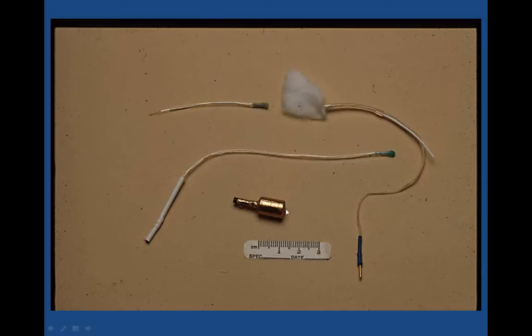And then, of course, this is a very popular electrode. I would say a lot of clinicians who are doing electrocochleography today in their clinics are using this electrode and using the ear canal recording approach. We abandoned that several years ago simply because it's not nearly as sensitive and stable as the recordings we get from the tympanic membrane. Nonetheless, if you cut this down a little bit and get it real close to the eardrum, you might get responses that are similar, but in our experience it's still not as good as the recording directly from the tympanic membrane itself.